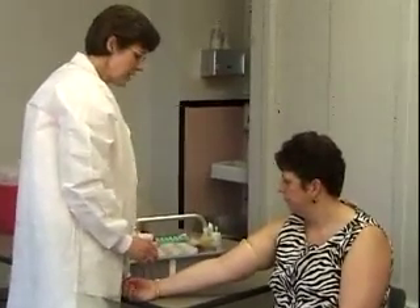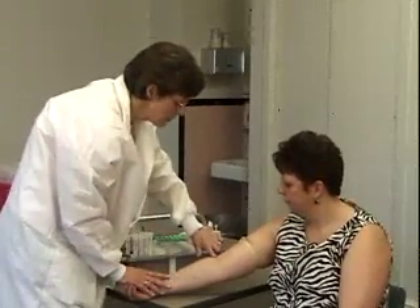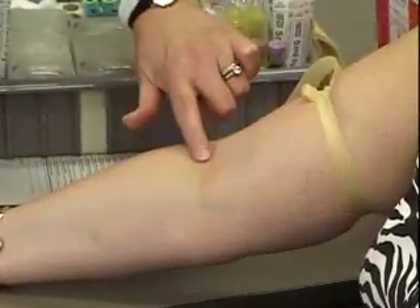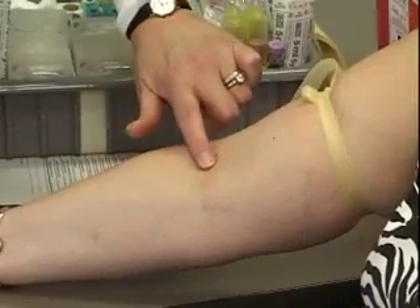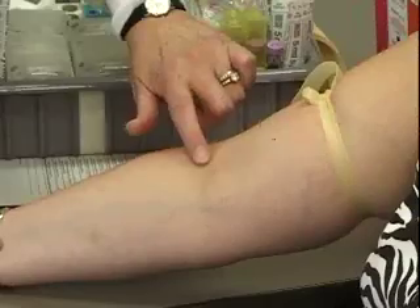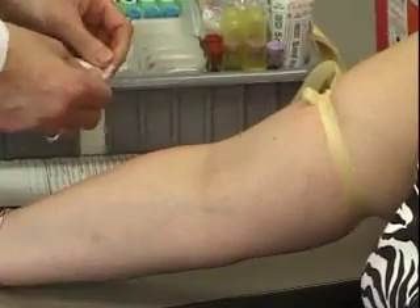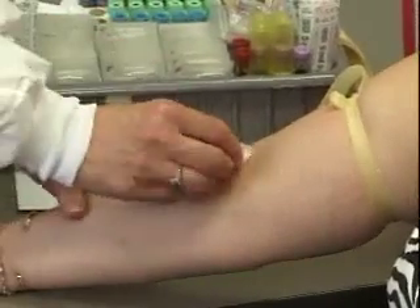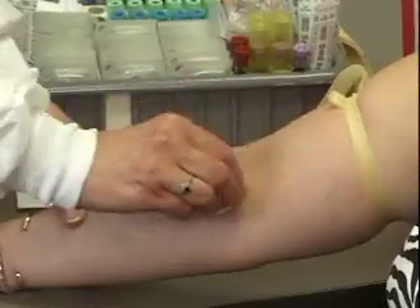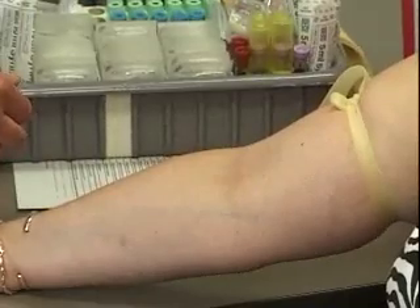The first thing I'm going to do is clean the area after I decide which vein I'm going to use. I'm going to palpate across the area — a vein will be very spongy and very giving. She has an excellent vein right here, and I'm going to clean it with an alcohol pad, cleaning from the inside out. You want to let the alcohol air dry, so you will have to wait about 30 to 40 seconds.